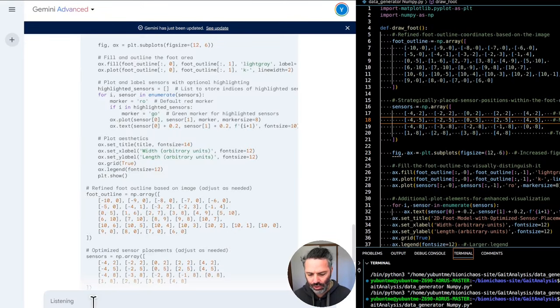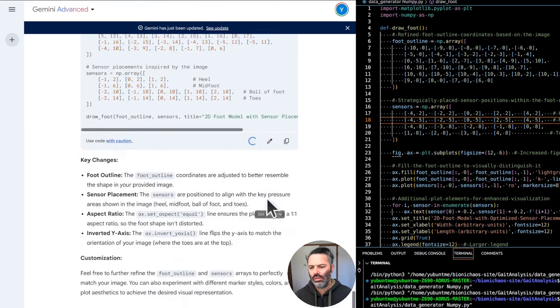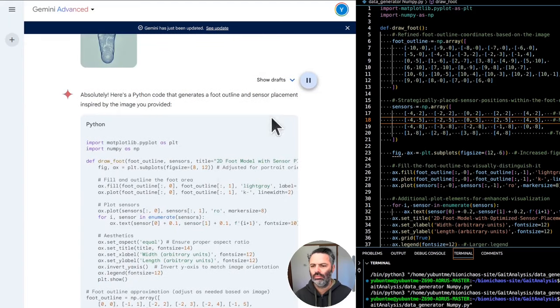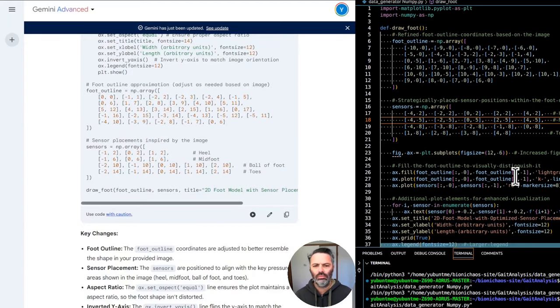It should look something like this. Can you try regenerating the Python code from scratch? Absolutely. Here's Python code that generates a foot outline and sensor placement inspired by the image you provided.